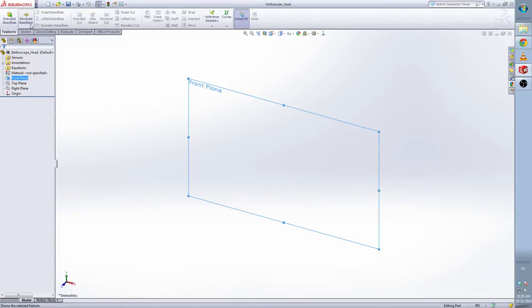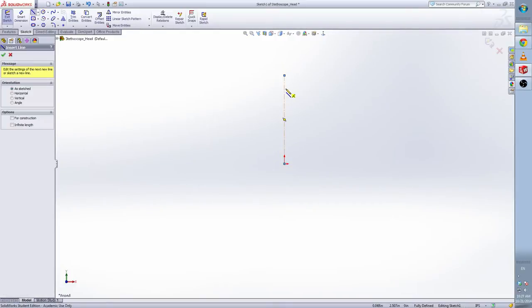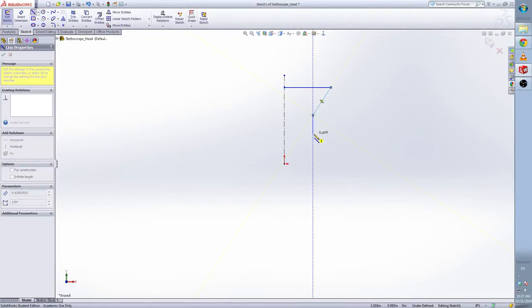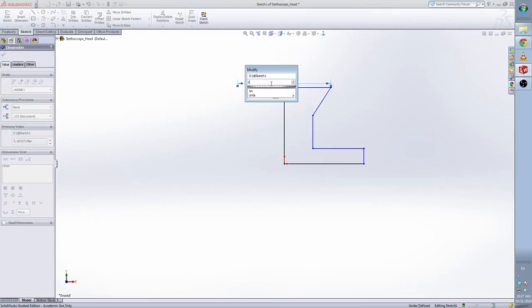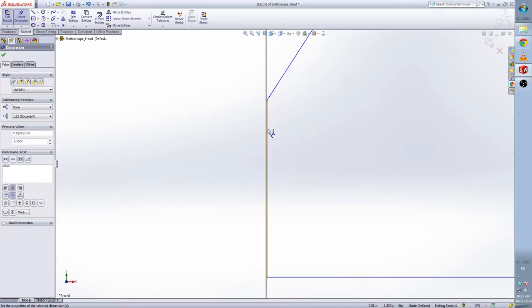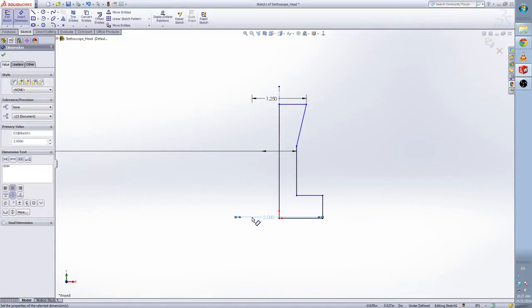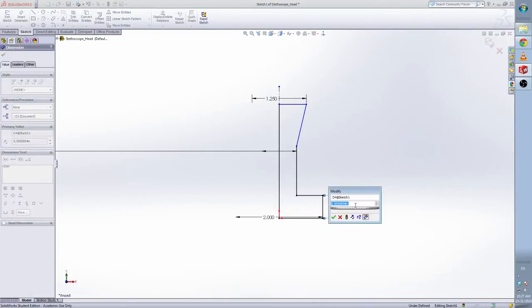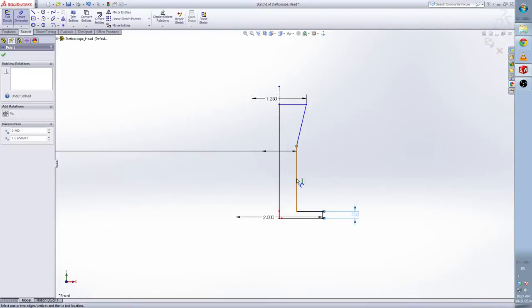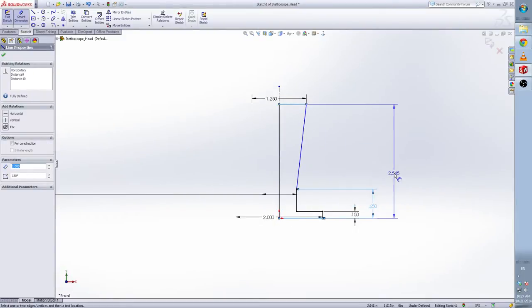Now select the front plane and make a revolve base. We draw a center line first and then use the line. Give the smart dimension. This is 1.25, this is 0.8, this is 2. Now we're gonna make the height. The height from here to here is 0.15. From here to the base is 0.65, and the total height is 1.25.